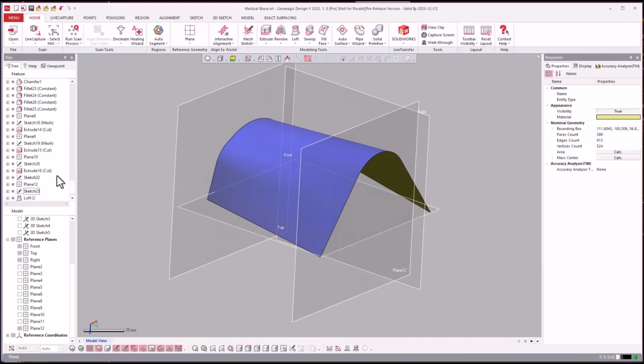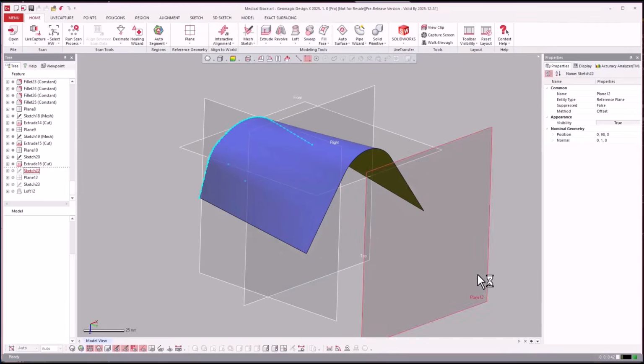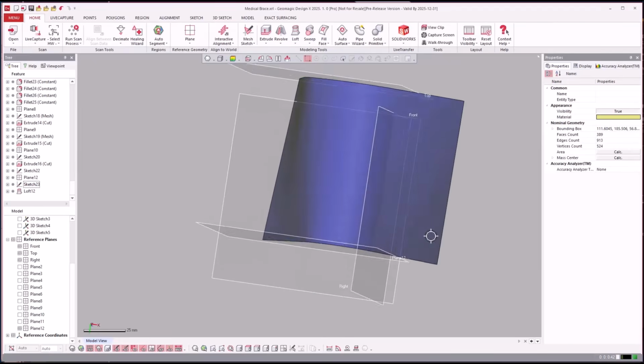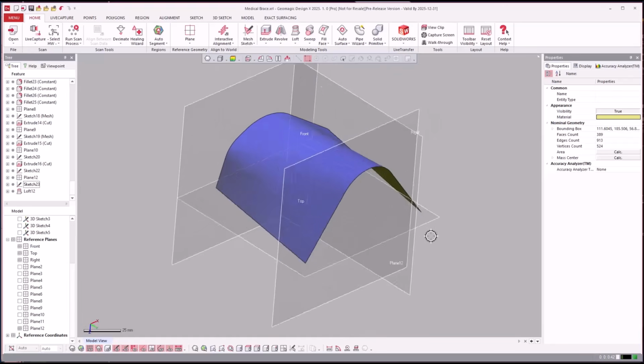Now, you can also control that even more. Let's double click on the spline, and make sure the spline has, okay, it has 44. Let's just make it 50 nodes. So it's going to redo the nodes on that spline so it has 50. And then this one, I roll over it. It's only got 32. Let's make it 50 so it's nice even. And then it'll make it even smoother. So we have a cleaner lofted surface.